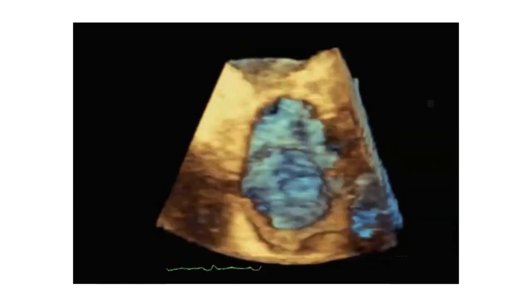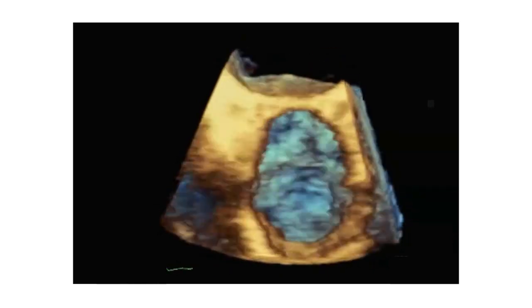Yeah, I think it's just fascinating what this technique is able to do. Of course, this is something that you will maybe learn in the future courses that you might visit. But at this point, important for you is just to understand that the aortic valve is still a 3-dimensional structure. And when you image, you have to be aware of this and always scan back and forth so that you have the entire aortic valve in your field of view. That way, you will be much more sensitive with respect to diagnosing, for example, aortic stenosis or actually any pathology.